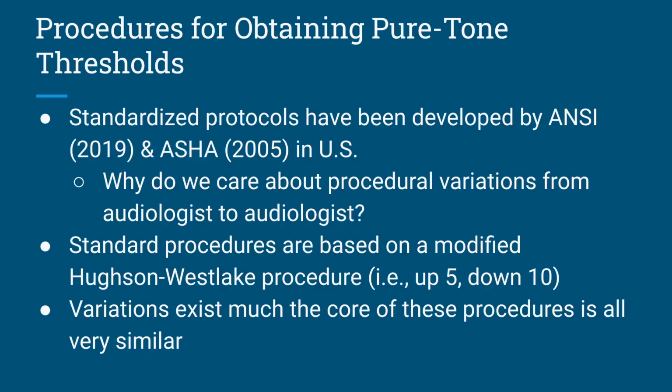So, why do we care about procedural variations from audiologist to audiologist? Standard procedures are based on modified Hughson-Westlake procedures, 5 up, 10 down. Variations exist, but much of the core of these procedures is all very similar.